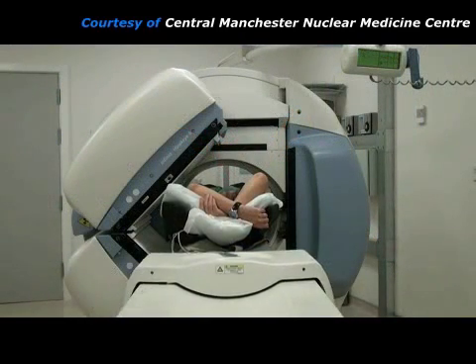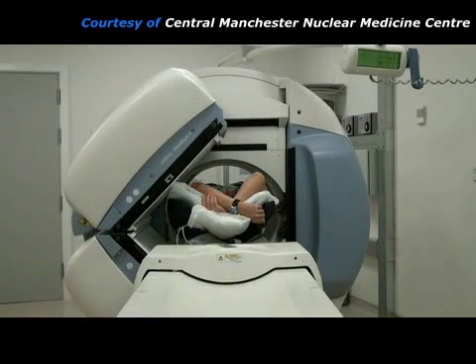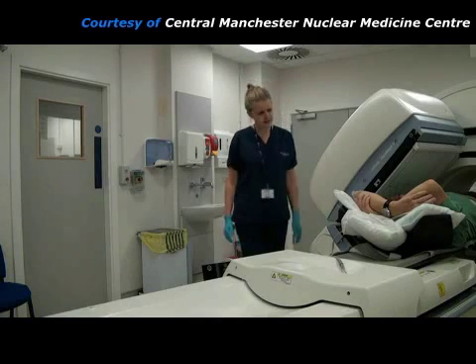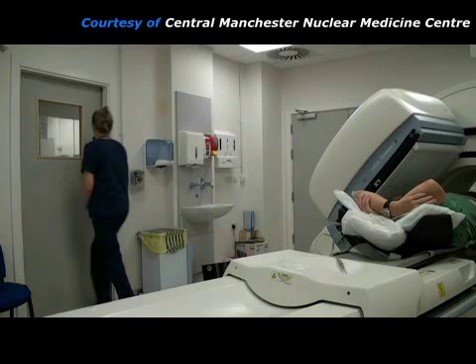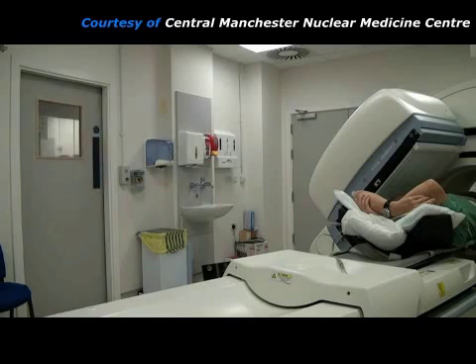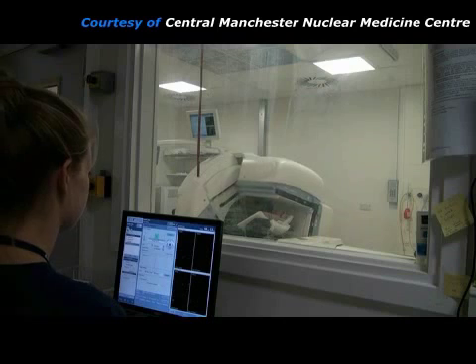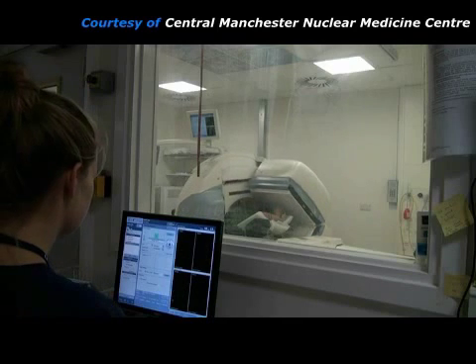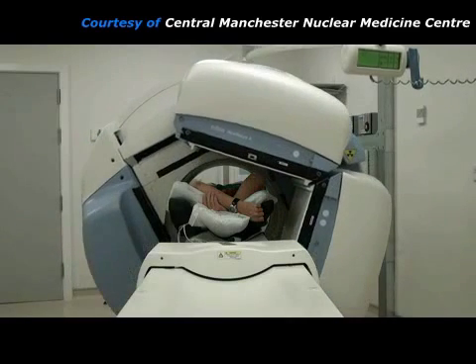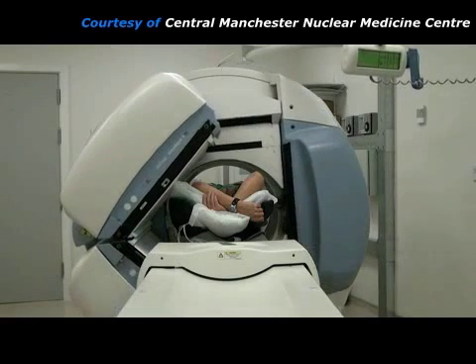It is now common practice to take some further images using a low dose x-ray CT scanner attached to the gamma camera. For this, the imaging couch has to move further into the gantry. During this part of the test, the practitioner will have to go into the control room for a few minutes whilst the x-rays are on, but she can still watch the patient through a lead glass window. The data from this low dose CT scan will be used to apply corrections to the gamma camera images, which improve the accuracy of the test.